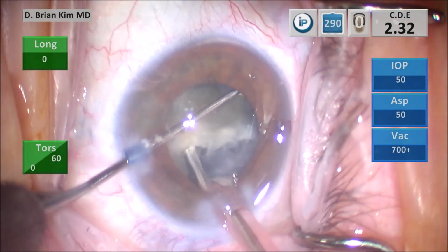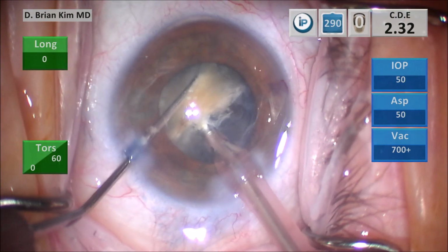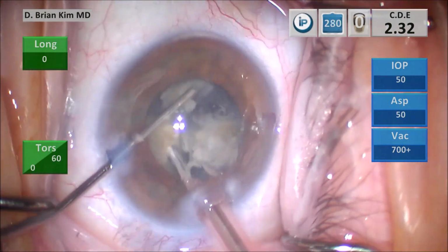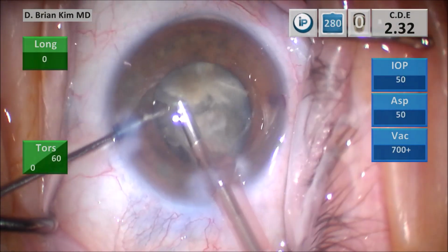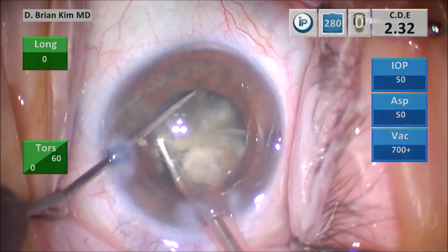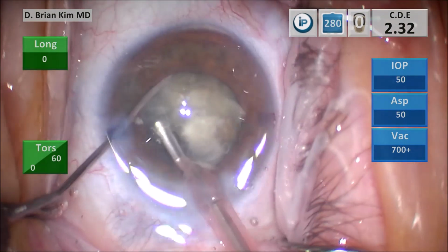Placing the chopper around the lens once again, keeping the fingertip deep, bringing the instruments together, feeling the thickness and the girth of the lens, and then crushing it with mechanical forces. Again, carefully spreading the instruments, which will cause separation of the lens pieces from one another. So I have three little pieces here now, getting the chopper around that other piece there, crushing it and dividing it.